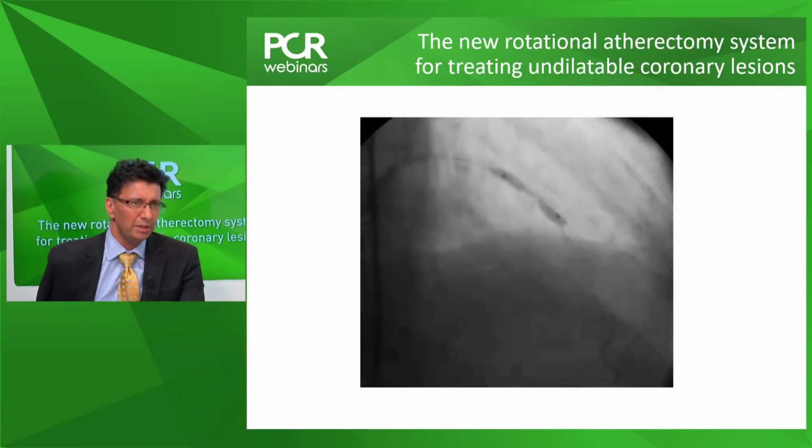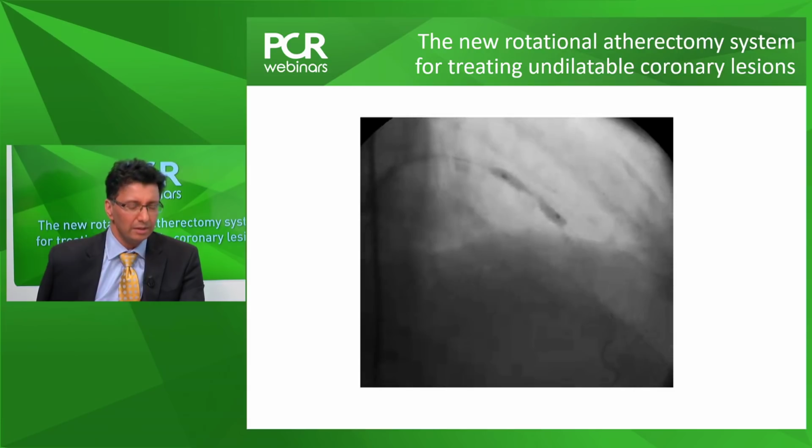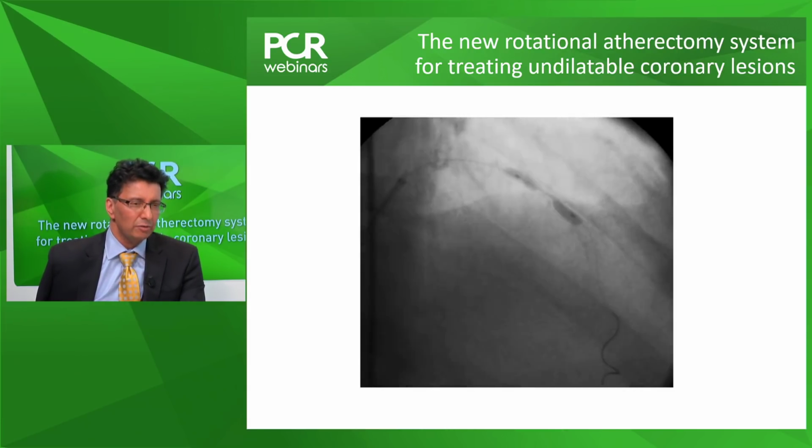And certainly in the very early days of rotational atherectomy, the emphasis was on heavy debulking with large burrs, often greater than 0.7 burr to artery ratio. But we've learned, through randomized studies, that that sort of technique isn't required. Randomized studies have shown that burr to artery ratios of less than 0.7 achieve the same lesion success, but dramatically reduce the complications. And that's very important.